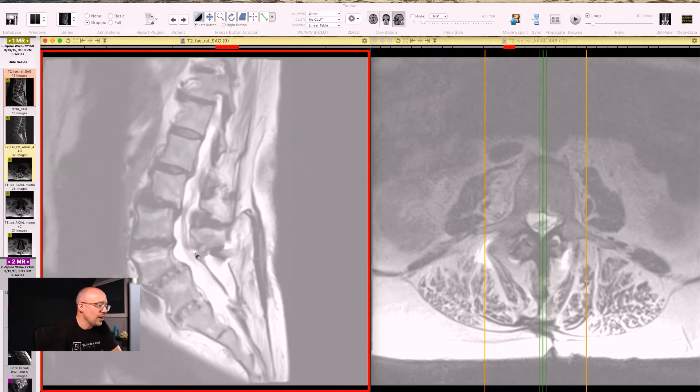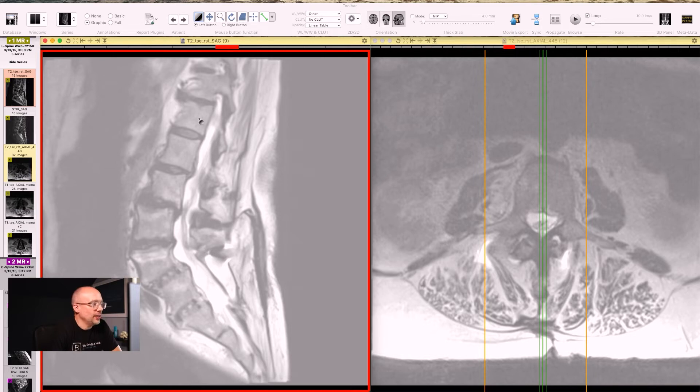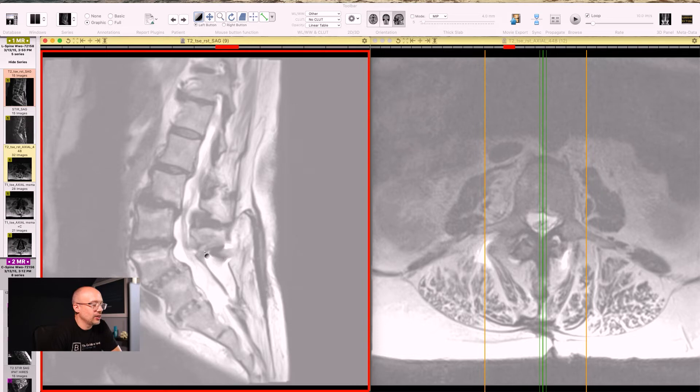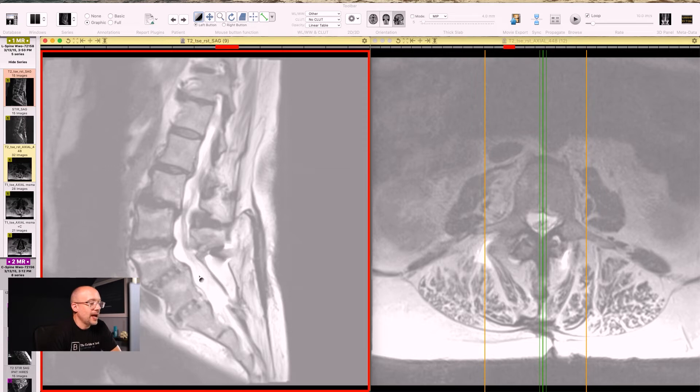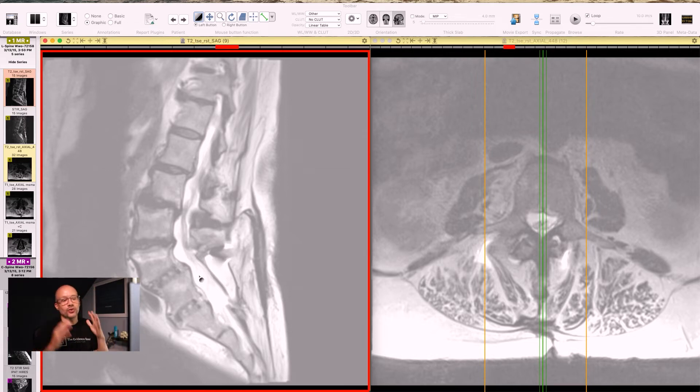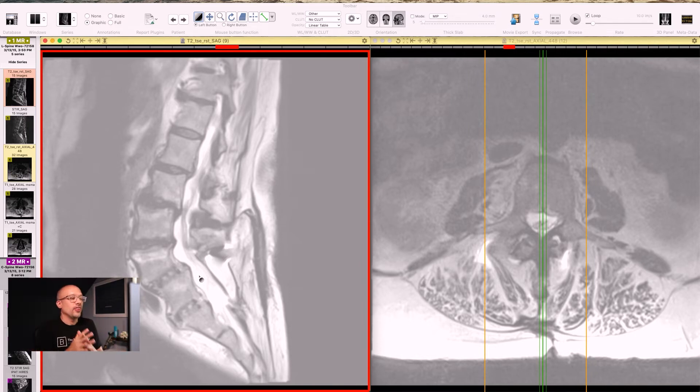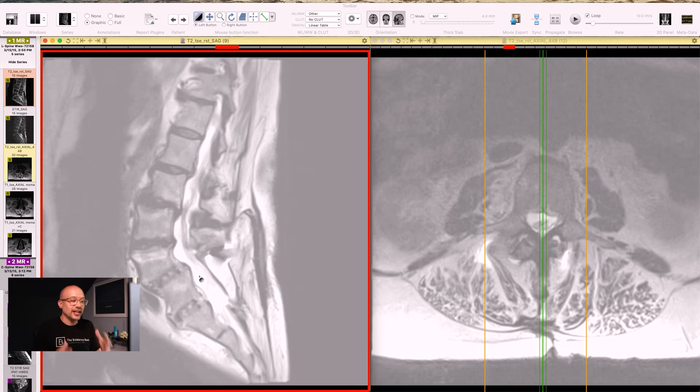One other thing you might note and see very quickly on this image on the left-hand side is there is this big, weird pocket of white stuff hanging out behind where the spinal canal is. That is a large, large fluid collection. So that is a fluid collection that has happened as a result of the surgery. Now, in almost every single lumbar, or cervical for that matter, almost in every single spine fusion, there is fluid that gets collected in the area.